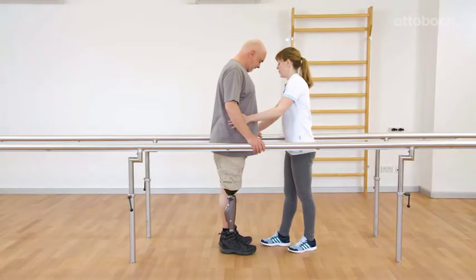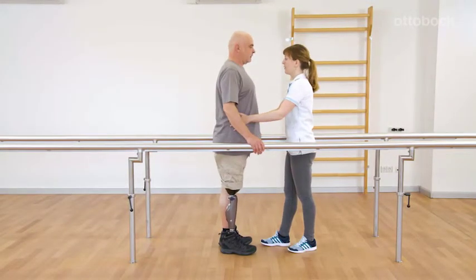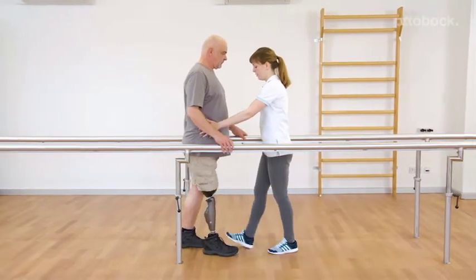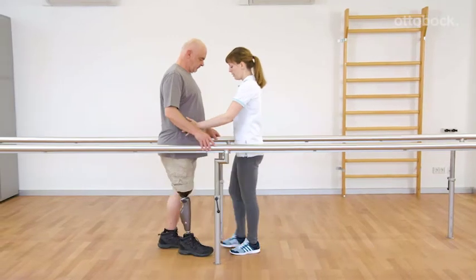Due to the embedded sensors in the knee joint, backwards walking is detected. Stance release is disabled during backward steps.